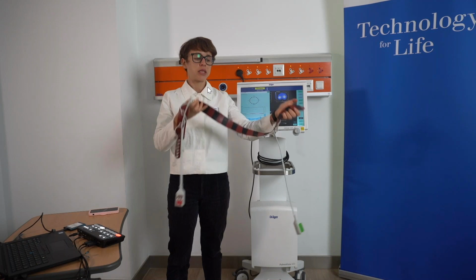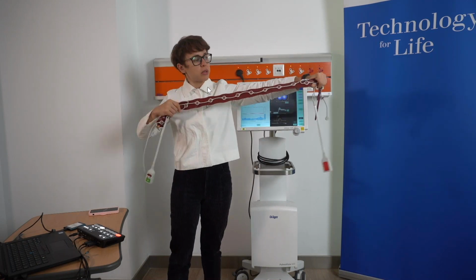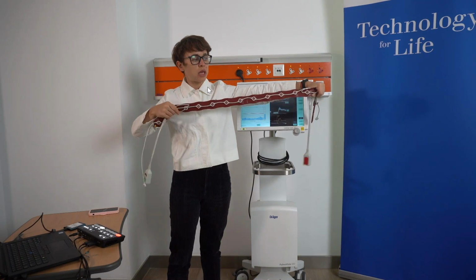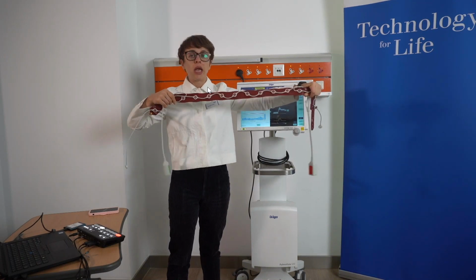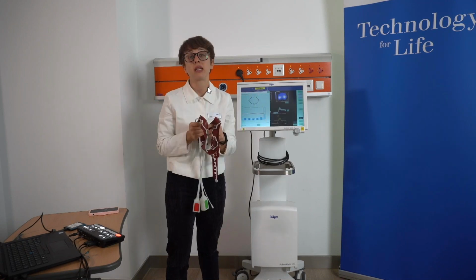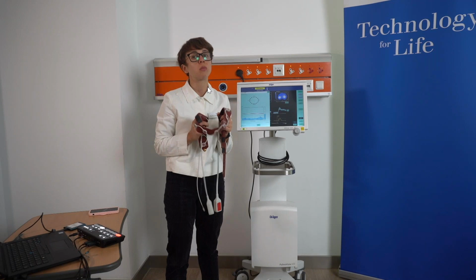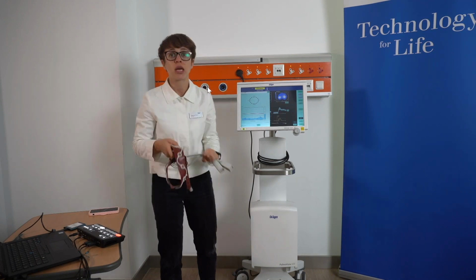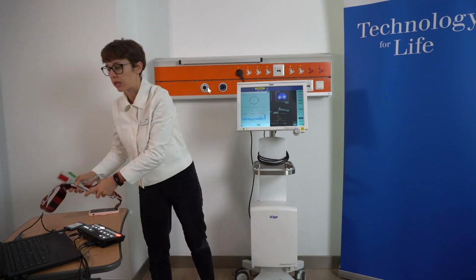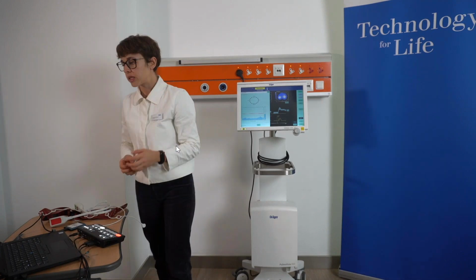You see, the belt is elastic and the electrodes are positioned in such a way that they can easily stretch. So even if we stretch it a little, it will not have a significant impact on the thoracic compliance. But if the belt is too small for the patient, we might have pressure from it and we might have an impact on the thoracic compliance. Okay, thank you for the question.